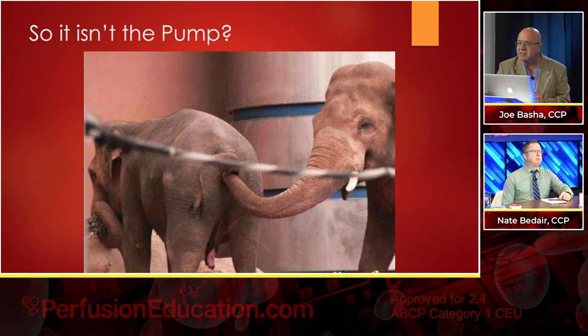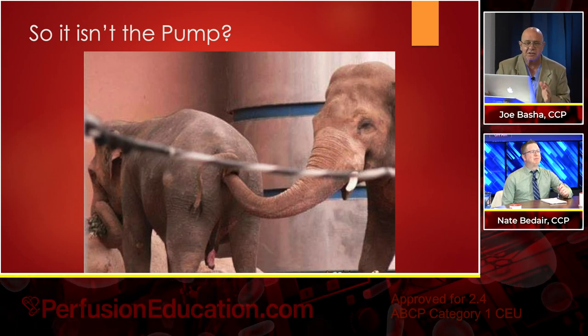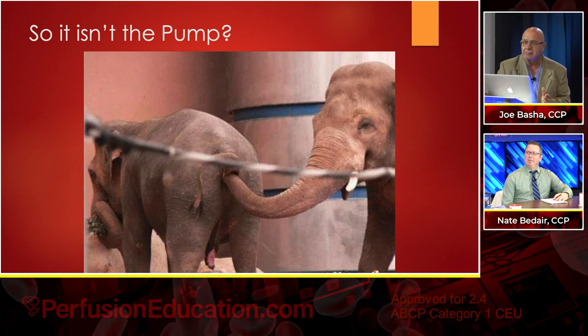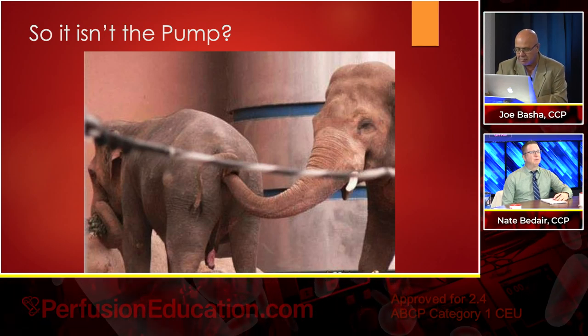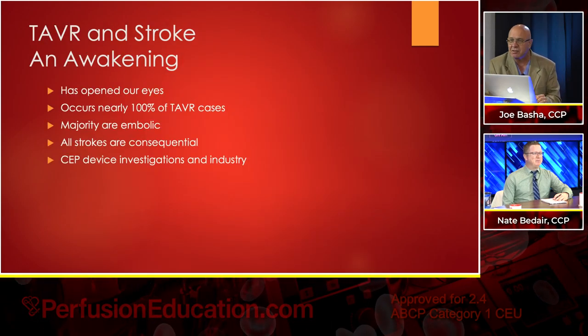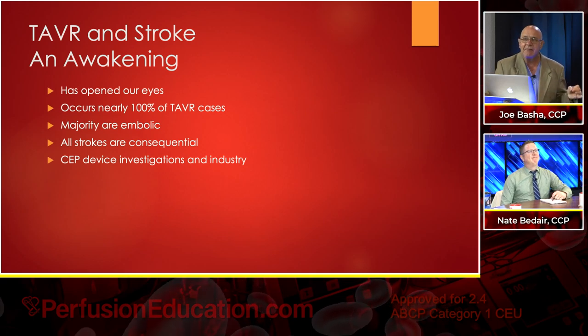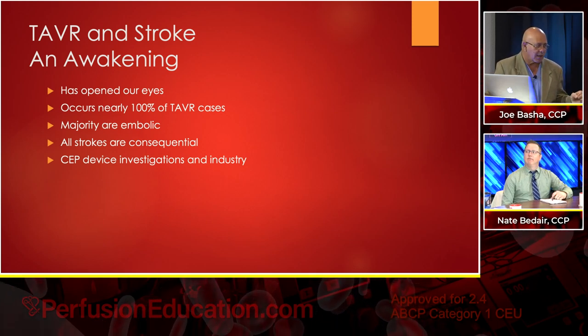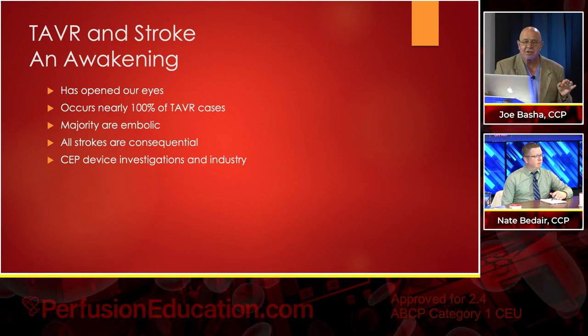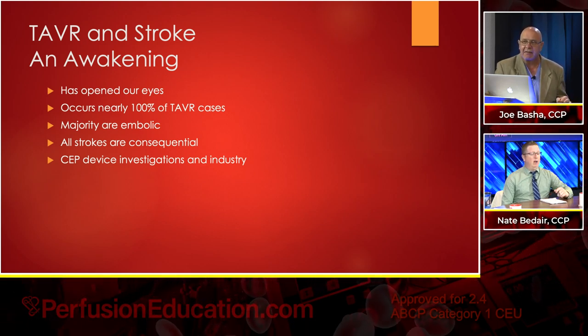Now, I want you to soak this in if you're watching at home, and I want you to just think about it for a minute, okay? Just think about it. Okay, that's probably long enough. If you're not traumatized before, you're traumatized now. TAVR and stroke has been an awakening. A stroke occurs during a TAVR. Wow, I did not know that.